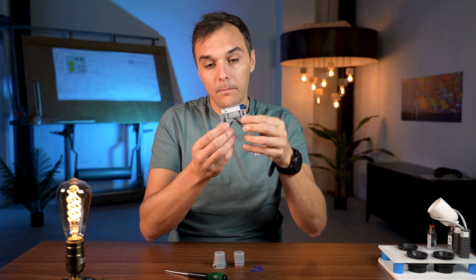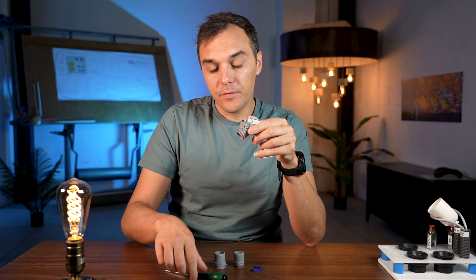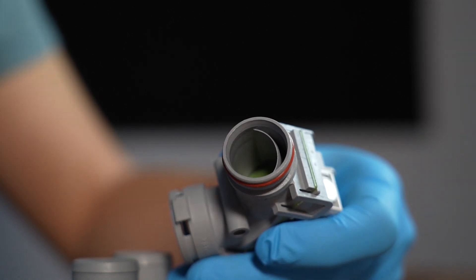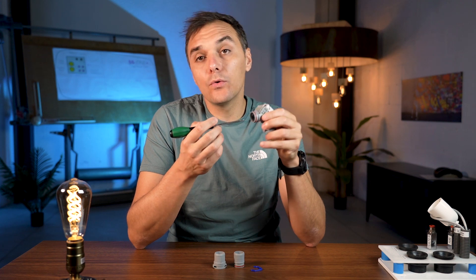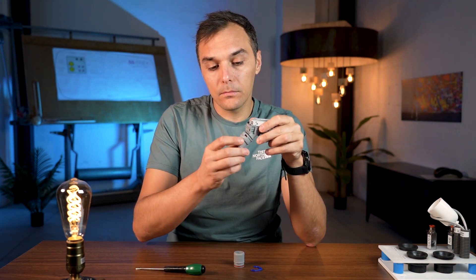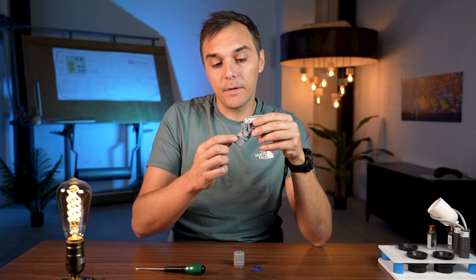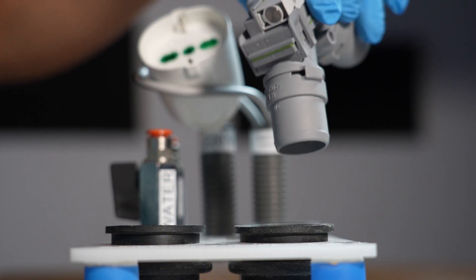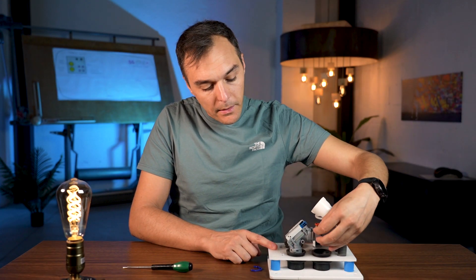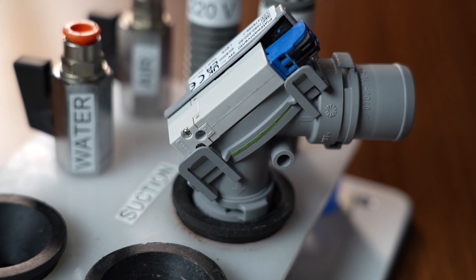Another important thing is to keep the valve straight and avoid any curve directly at the top, if possible, because inside there is a little chamber — like an air exit — that allows the valve to work properly. If water goes in there, we have a problem. To avoid this, we suggest using a straight connector at that position. We normally apply the valve at the chair base where the suction tube goes straight to the floor.